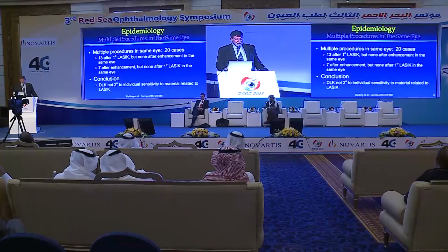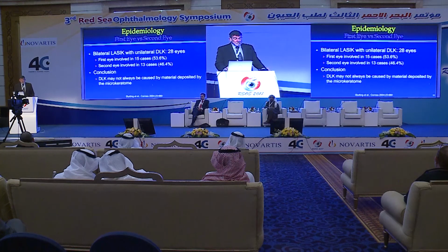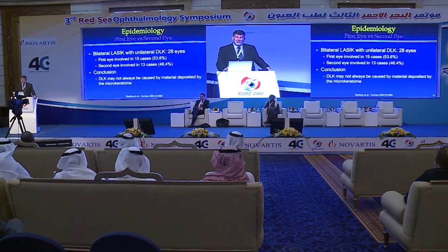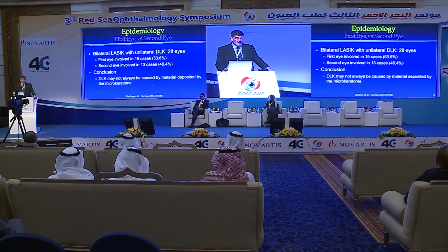So we took a look at multiple procedures in the same eyes, 13 after primary, but none after enhancement in the same eye. So we believe that DLK was not due to an individual sensitivity or to material related to LASIK. Bilateral LASIK with unilateral DLK occurred in 28 eyes, first eye in 15, second eye in 13. So we believe that DLK could not always be caused by material deposited by the microkeratome, because the second eye should not be involved if the first eye was not.